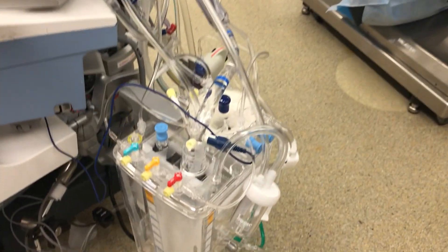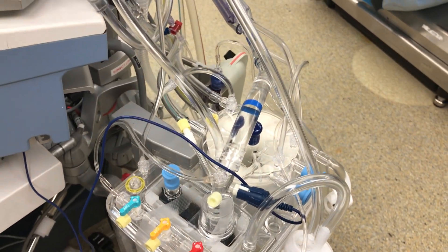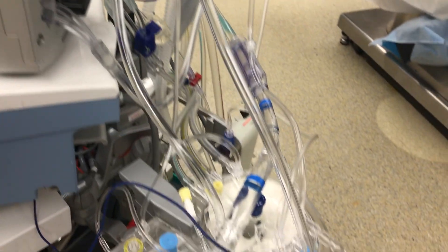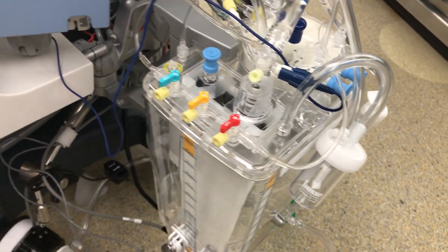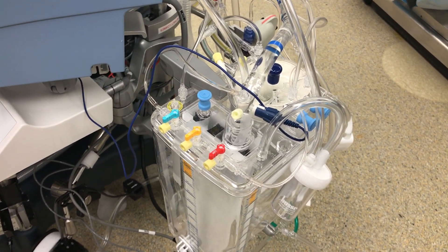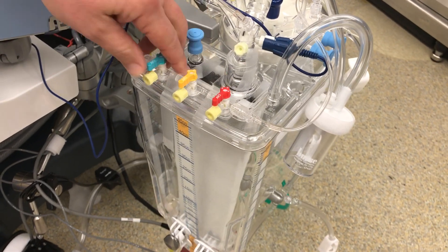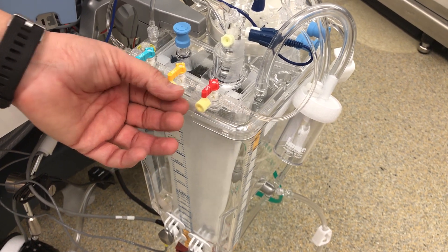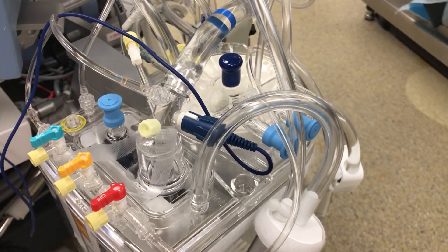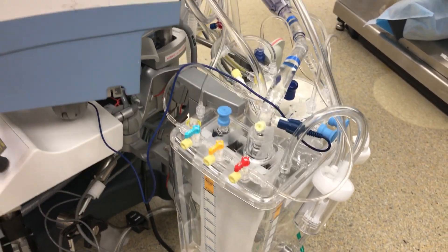All of this drains back into the reservoir, which is our blood source. These three tubes here are where blood comes back. This one here is where we add volume if we need to — if the level in the reservoir is too low, we will add Ringer's, Normosol, or saline. And if the crit is too low, we will add blood products, albumin, and other things to try and get the solution in the system as close to blood as we possibly can. This here is the manifold — it's basically an arterial line that empties back into the venous line, back into the reservoir. When we give drugs, they go in, mix with all of the volume in the reservoir, and then are put back into circulation.